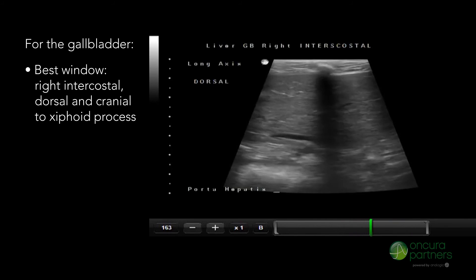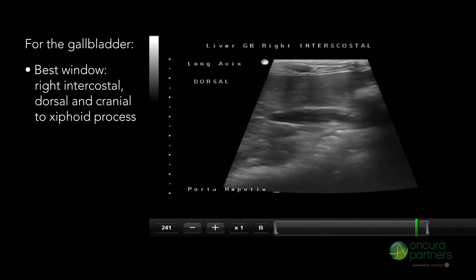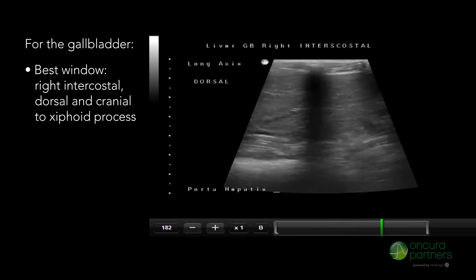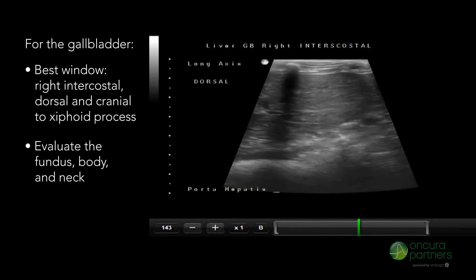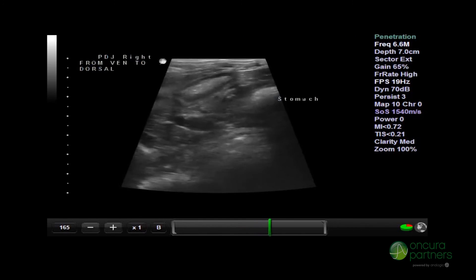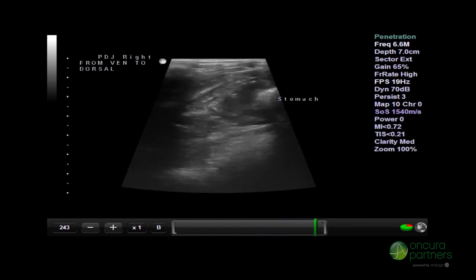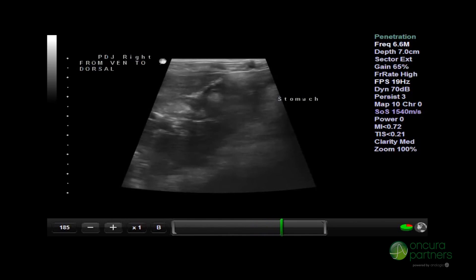The best window for visualization will be the right intercostal, dorsal and cranial to the xiphoid process. This window will allow the sonographer to evaluate the fundus, body, and neck of the gallbladder, especially if gallstones are suspected. The porta hepatis and the pyloric duodenal junction can also be evaluated using this technique, since the neck of the gallbladder can be used to identify this region.